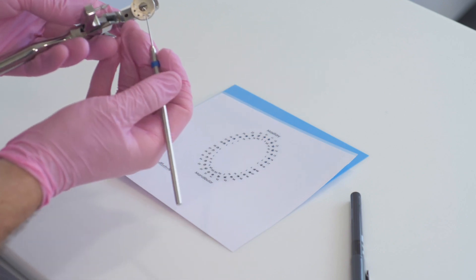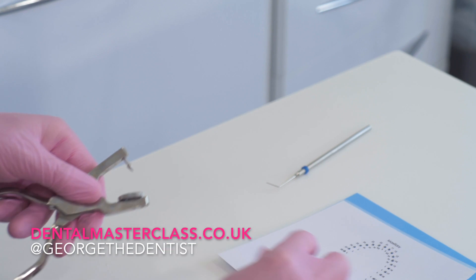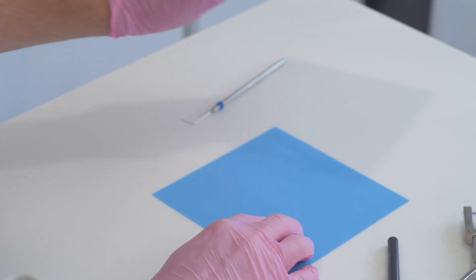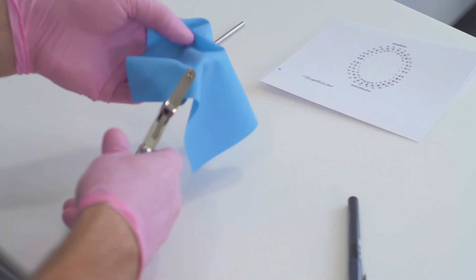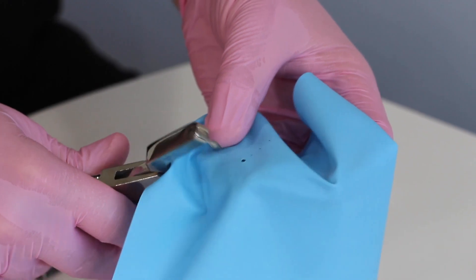First thing before you even start, use a probe and just make sure that these holes are cleared, because sometimes when you punch a rubber dam, little bits of the dam get caught in the punch. So I'm going to start with a large — make sure to centre my punch, take the frame off, aim towards the first hole, click it, and make sure you've pushed it all the way through, then let go.